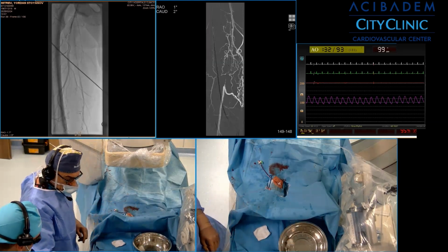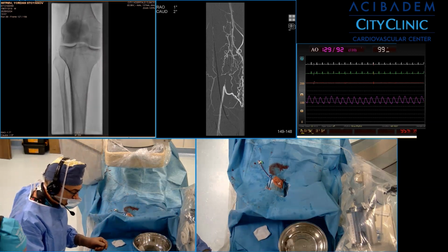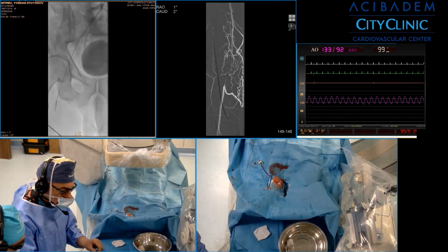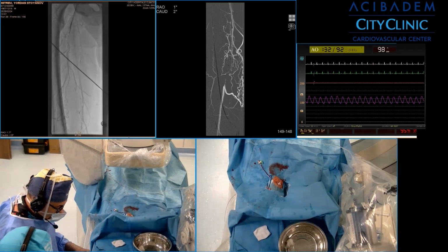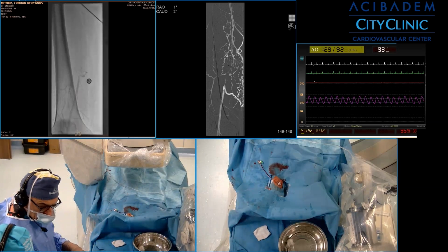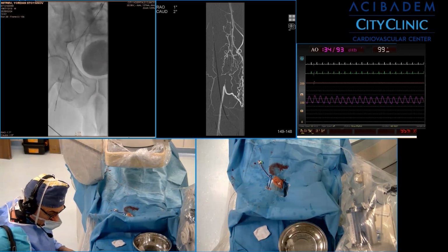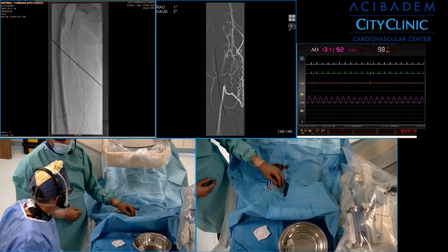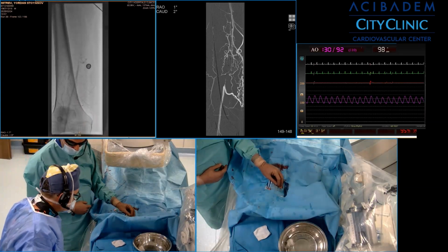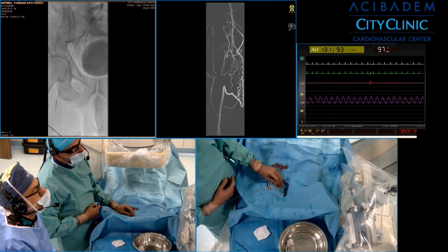And we'll try to puncture. There is a very small curve, you know, the cardiologists know what the Gaia the Third looks like. It has a very small curve on the tip, just in order to have the possibility to penetrate from here.